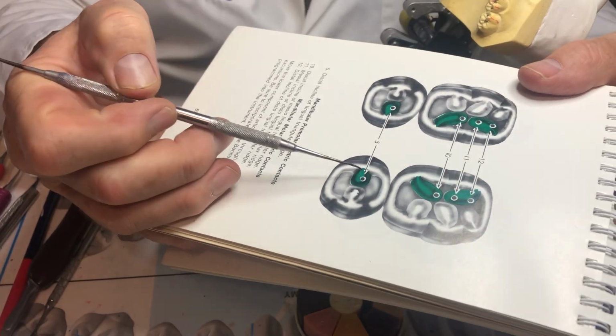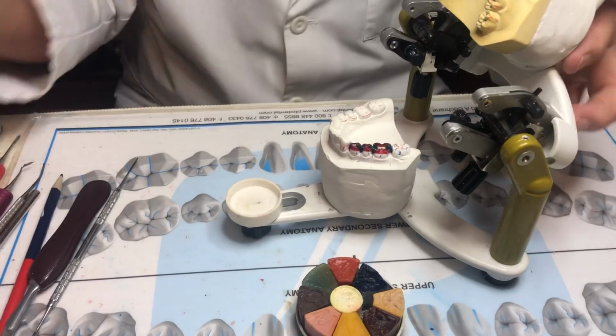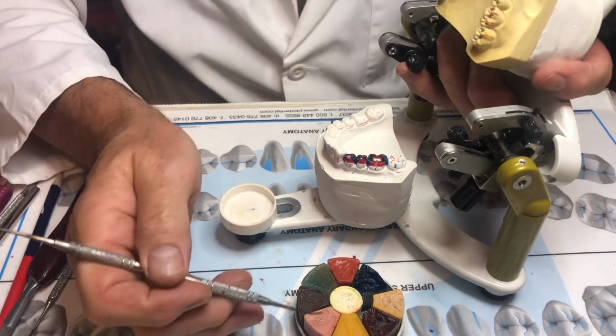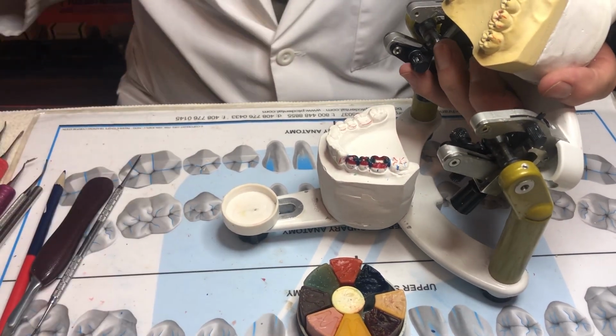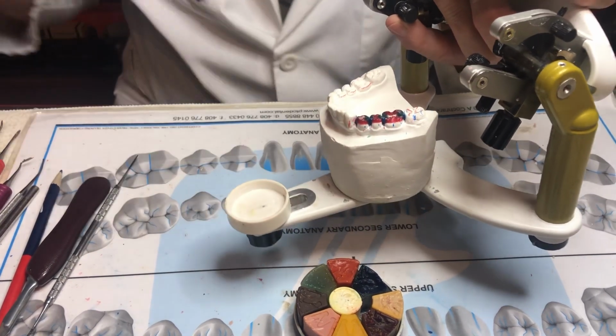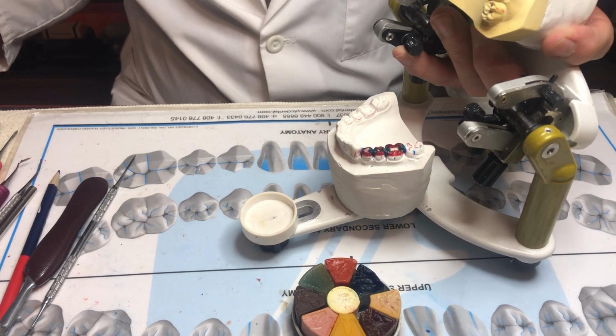I'll go to the lingual side and I'll do the other one. And again, you refer to the book each time. If you try to take shortcuts, it's never going to work. And then as the cases become more complicated, you'll just be more confused. So let's continue with this one.